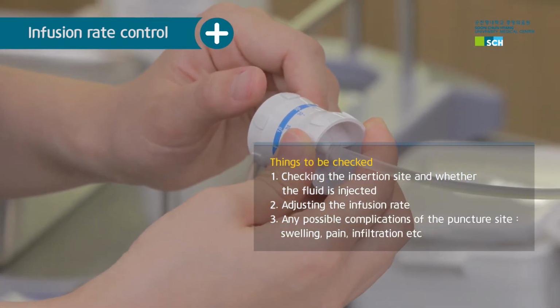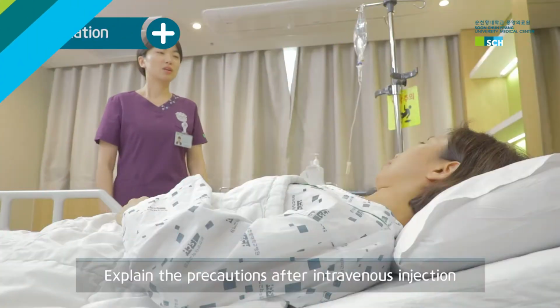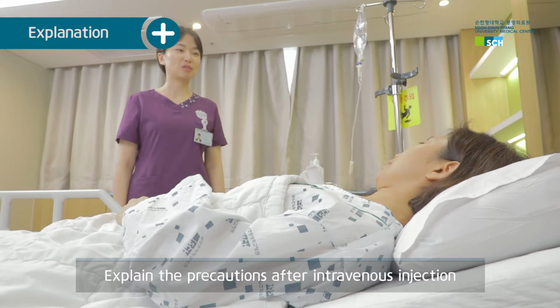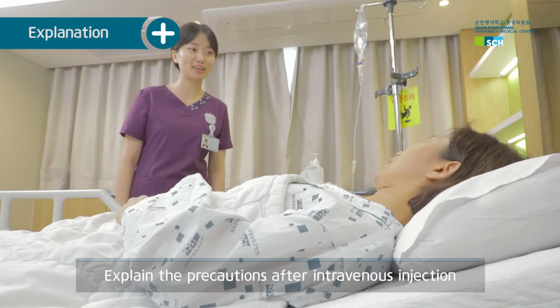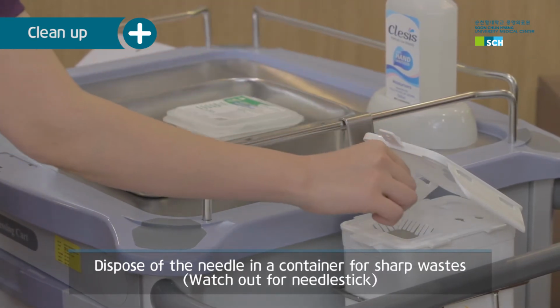After that, control the infusion rate of the fluid according to the physician's order. Ask the patient if he has any discomfort in the IV site and explain the precautions. Clean up the used equipment. Do not recap the needle.